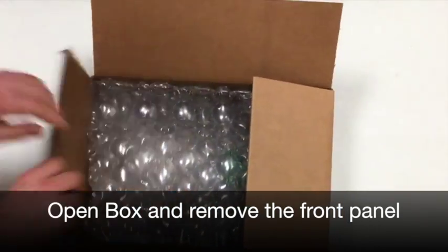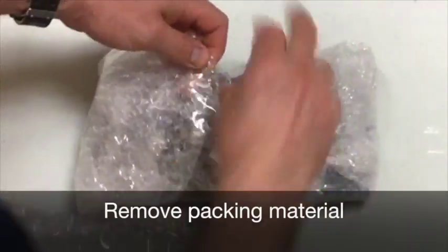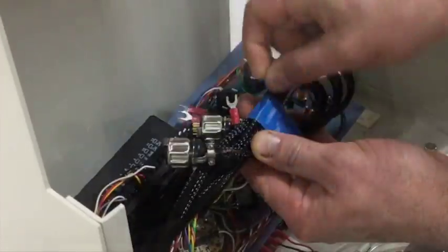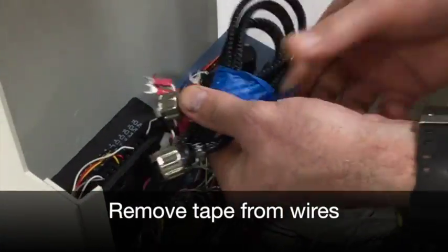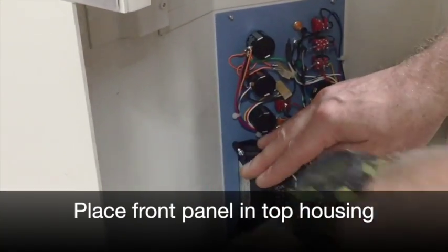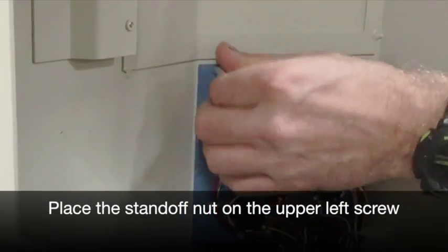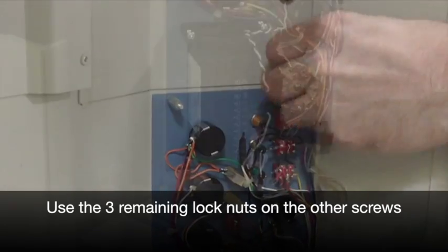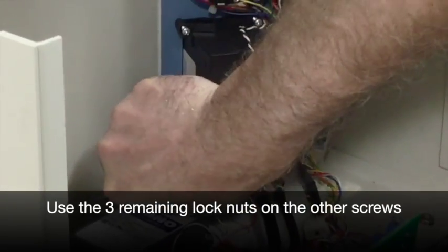Open the box and remove the front panel. Remove the packaging material and the bubble wrap. Remove the tape from the 3 black wires. Place the front panel on the top housing on the 4 screws. Place the long standoff nut in the upper left-hand corner, and then use the 3 remaining lock nuts on the other screws.